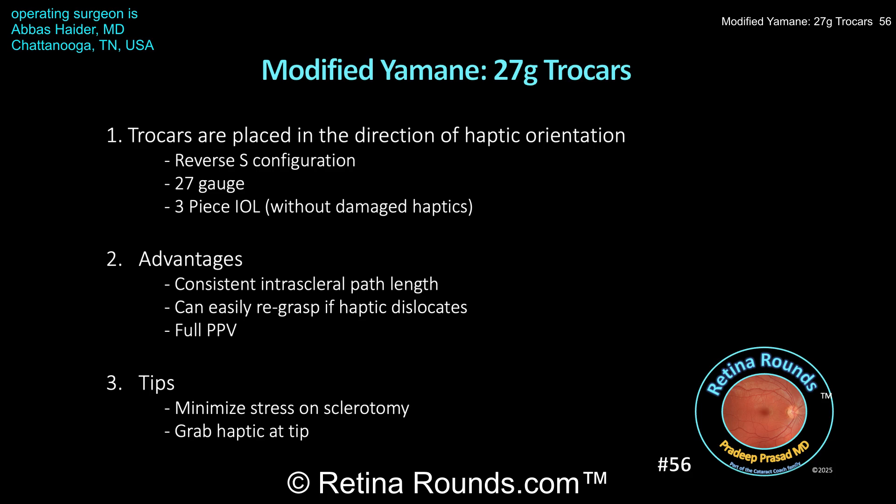Finally, this technique allows for a complete vitrectomy to be performed through the same trocars. However, if you're performing a vitrectomy, just make sure not to stress the sclerotomy sites too much, since they may not be tight enough to hold the flanged haptic. Also, prior to externalization, ensure that the tip of the haptic is grasped and that the haptic path is in line or parallel to the forcep. If the haptic is perpendicular to the forcep, it can kink upon externalization.